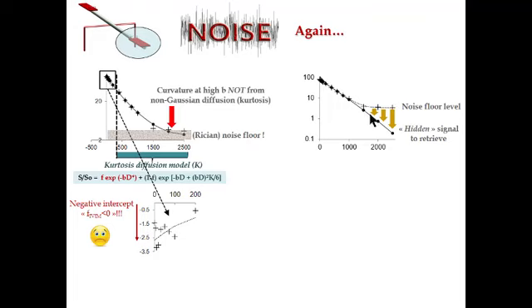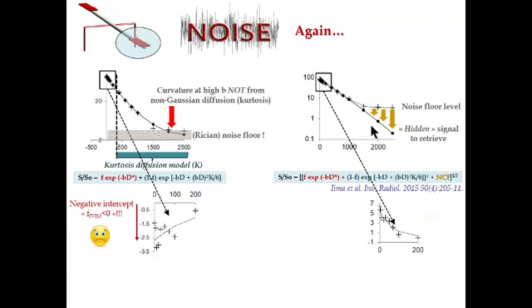So basically, to look at the signal which is in the noise, or at least to ignore the points here. If you process the signal properly, so you have the IVIM effect, the kurtosis diffusion model, and the correction for this noise floor, then if we remove the diffusion part from the overall signal, we are happy to see that we get the positive IVIM effect. Again, this is a typical tissue. It's not a simulation, it's real data.